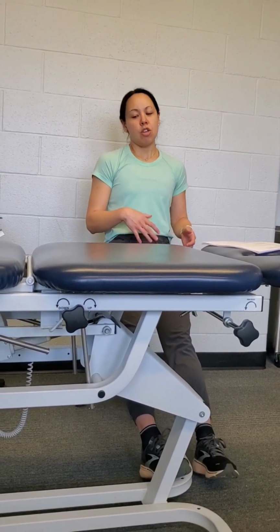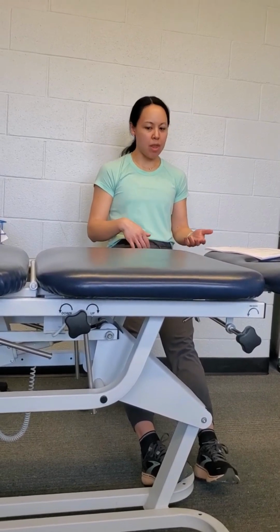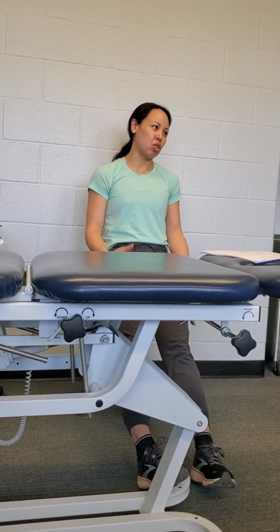Say they're literally just lying there, post-op day 3, let's say, and they are in so much pain and have a lot of swelling, and you're just doing it to get that physiological response, then they could be doing ankle pumps or quad sets and you can get away with it there. Or if they're literally just lying there doing nothing, then you can't technically charge for that.